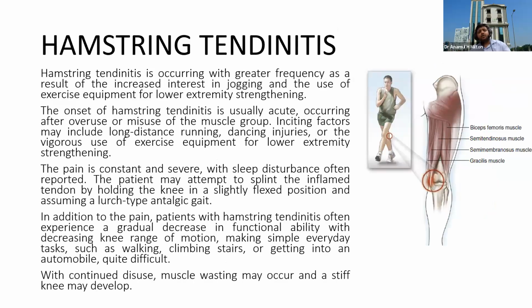And there is the unimportant that is important, and I am very close to the conclusion. So this is the hamstring tendon. The hamstring tendon comes from the lateral side and also the medial side. On the medial side there are two tendons, and on the lateral side there is the biceps femoris.